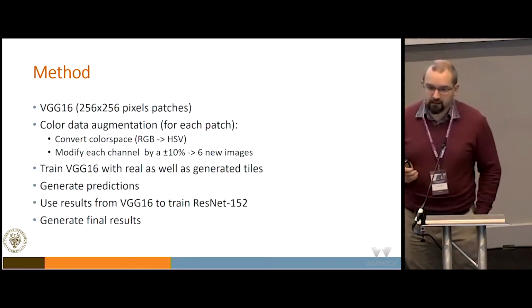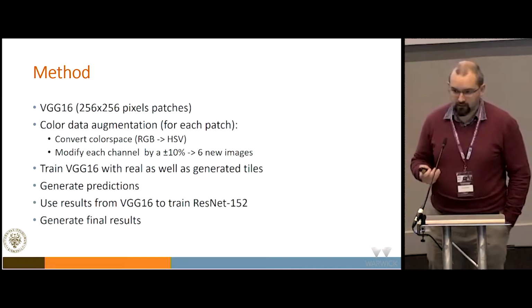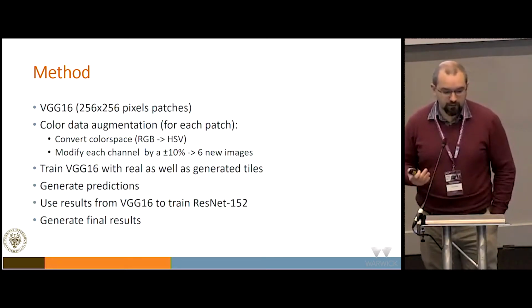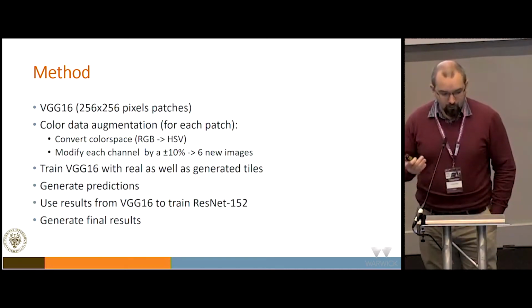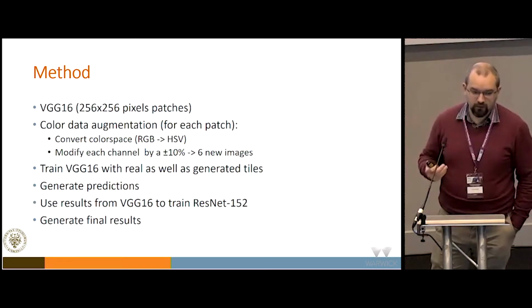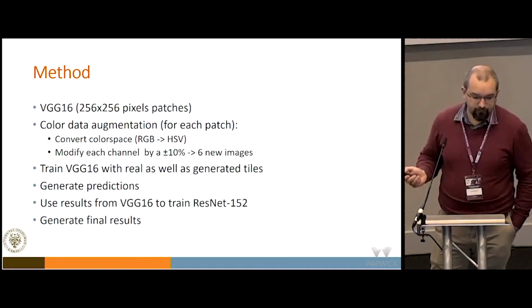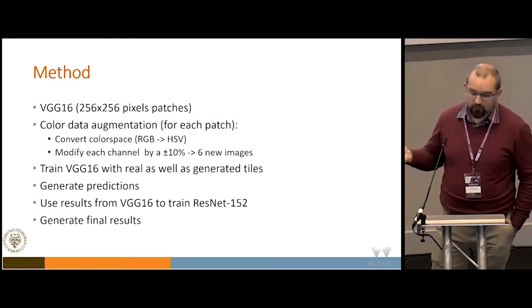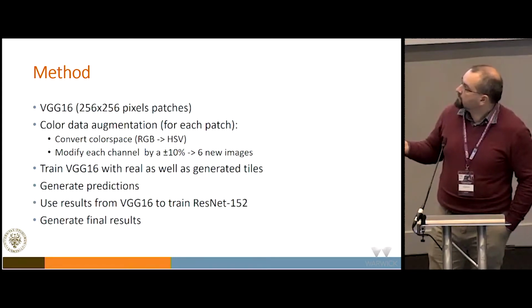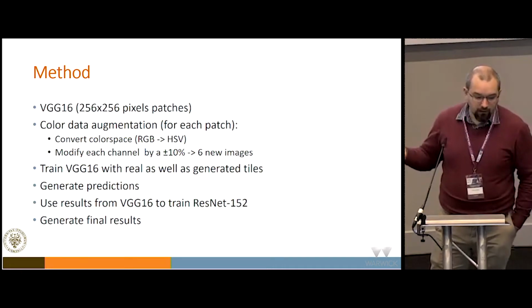Our method uses VGG16 for the first part of the training, where we also change the color of the images. We convert every tile that we give as an input to the HSV color space.